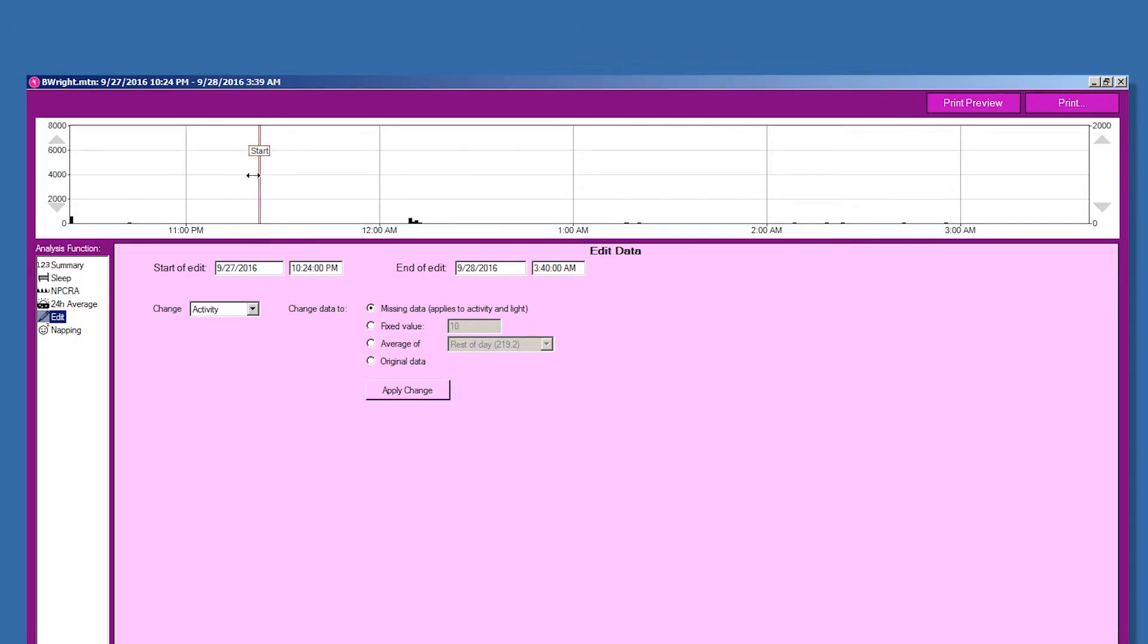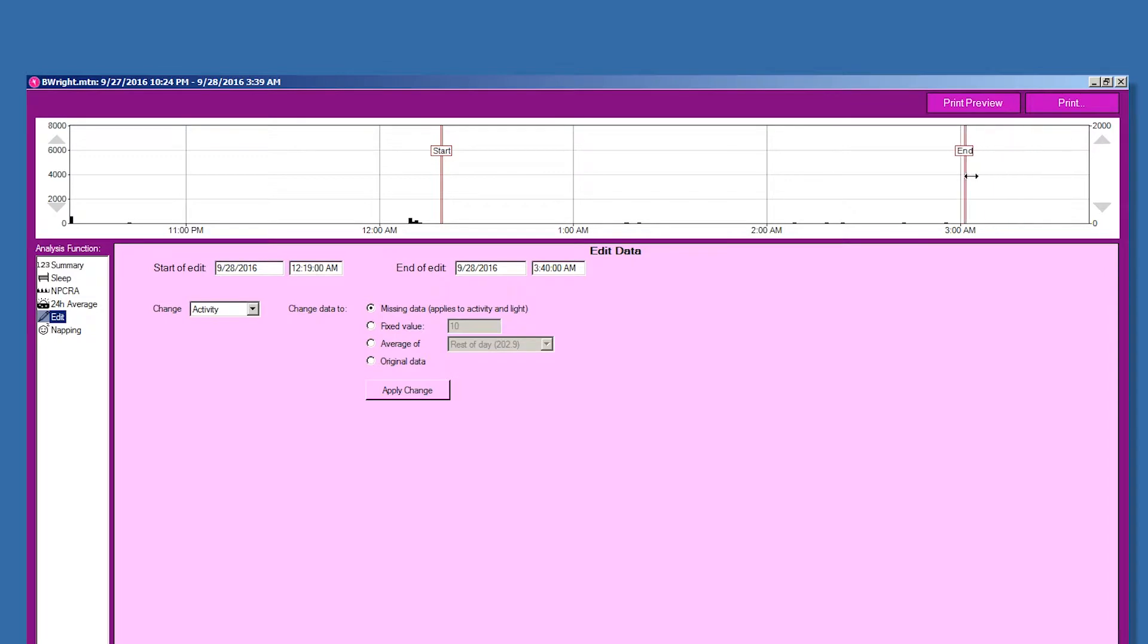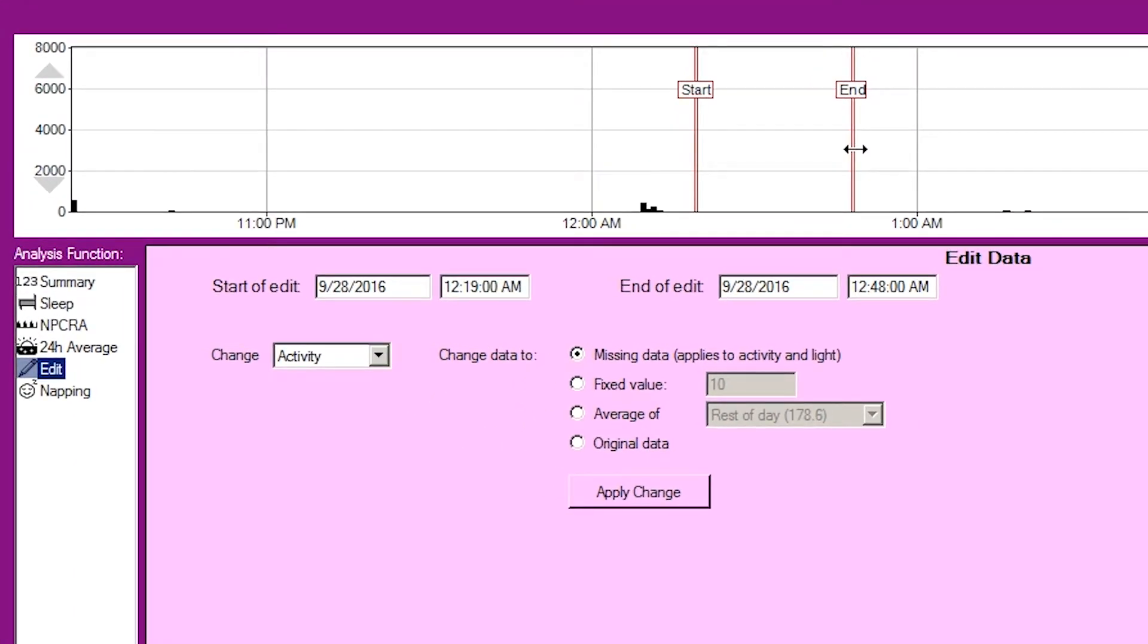After selecting the edit tool, it is possible to fine-tune the time period for the edit either by dragging the start and end bars on the graph or by changing the text boxes containing times below the graph.